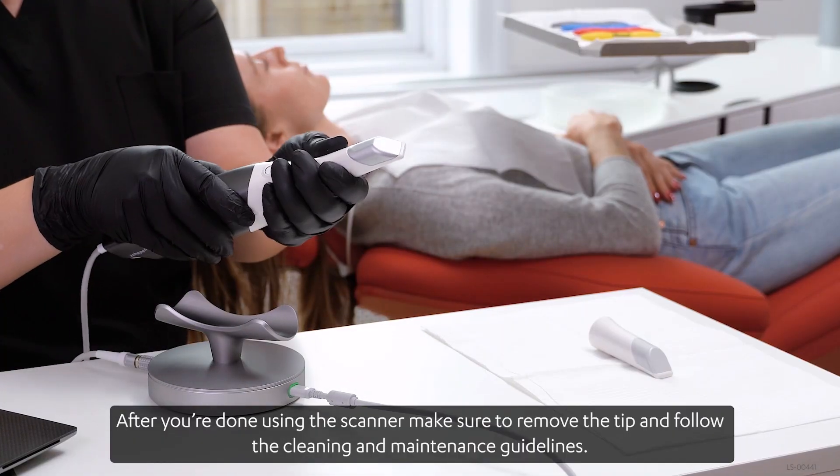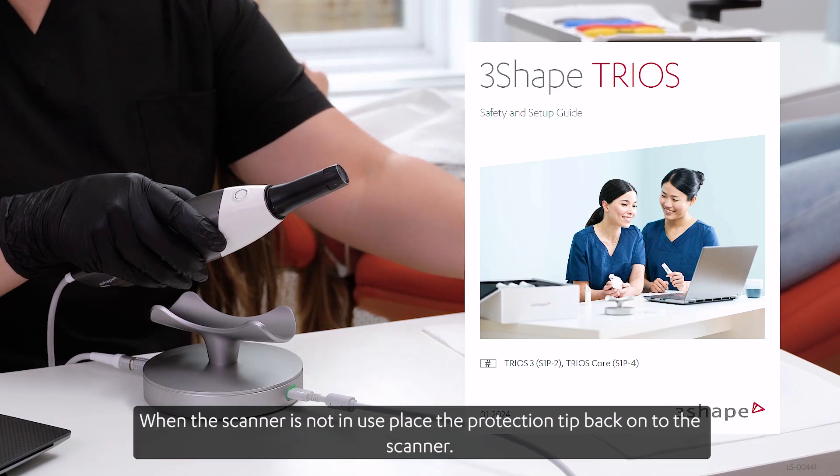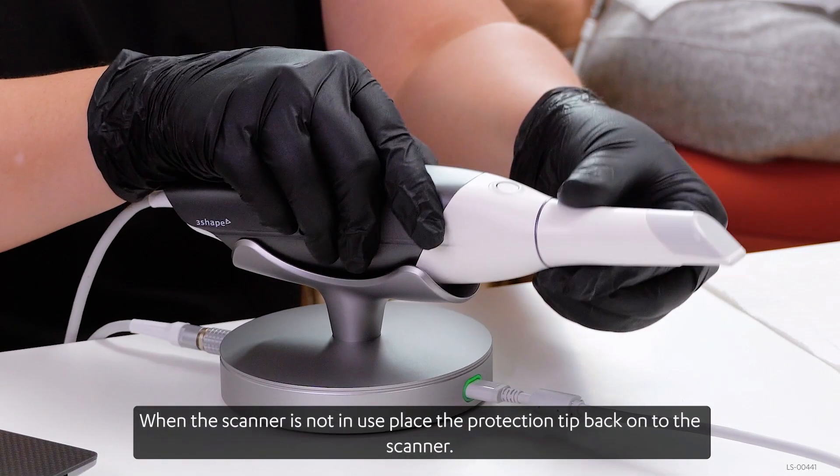After you're done using the scanner, make sure to remove the tip and follow the cleaning and maintenance guidelines. When the scanner is not in use, place the protection tip back onto the scanner.